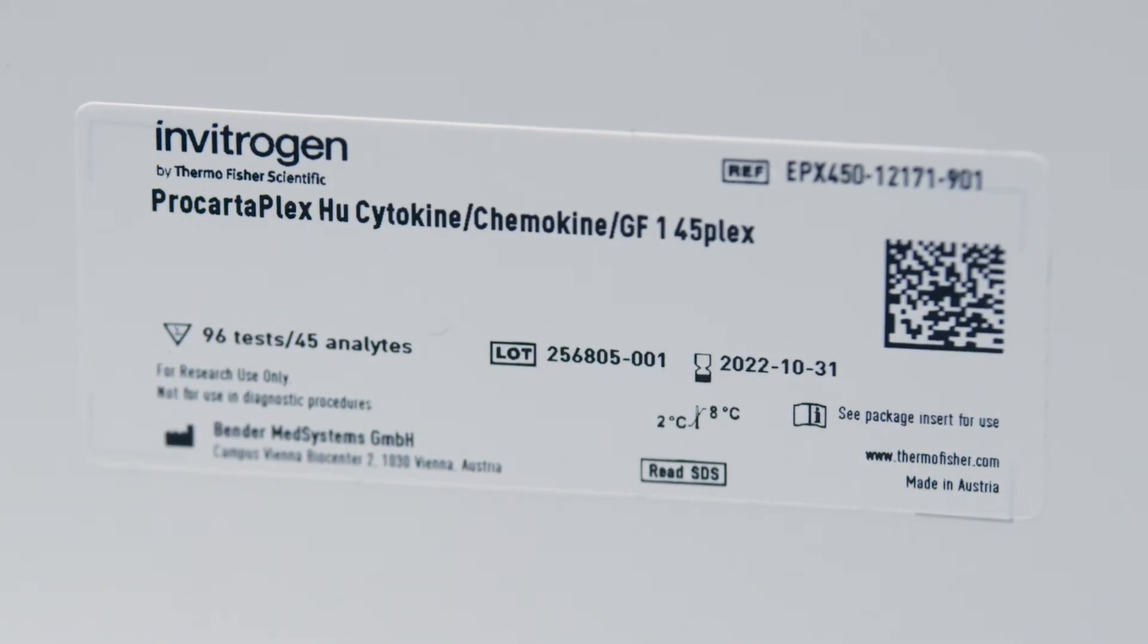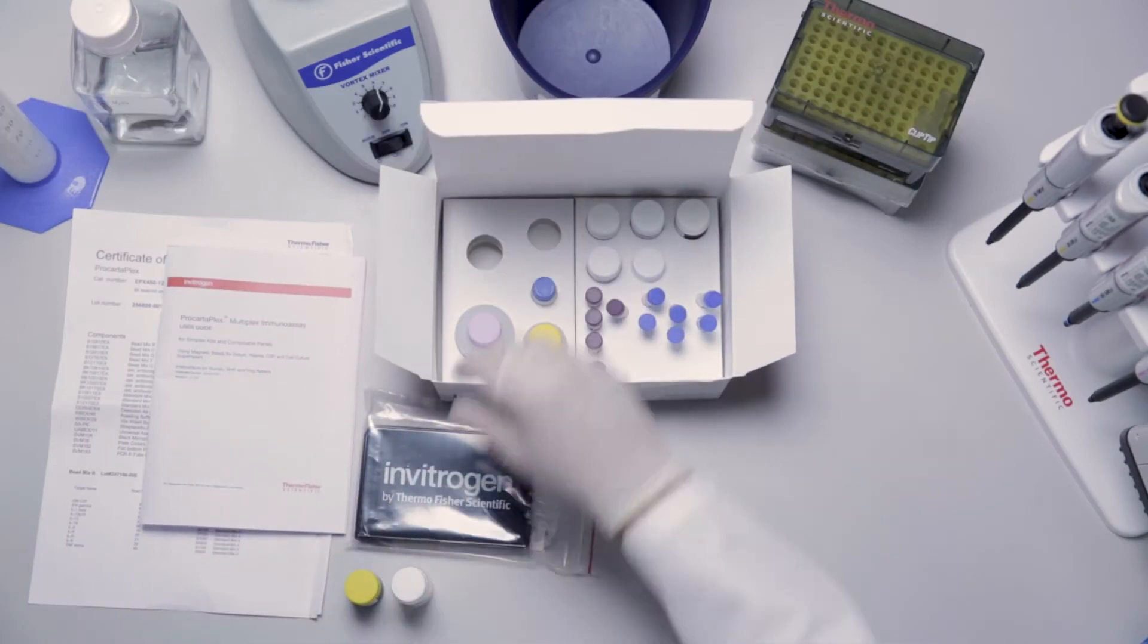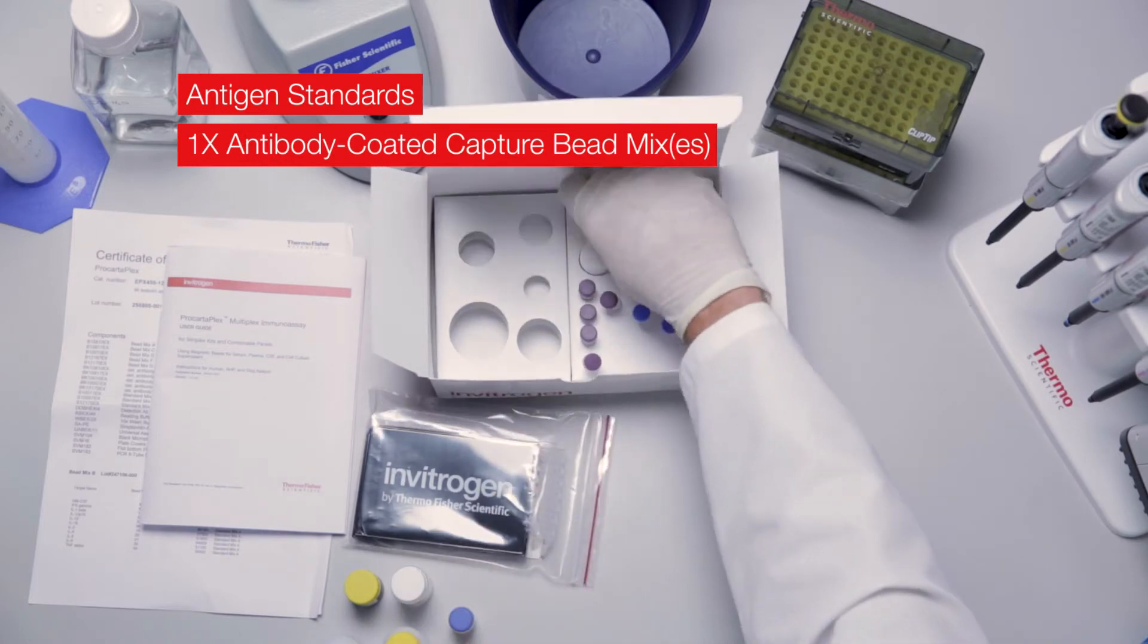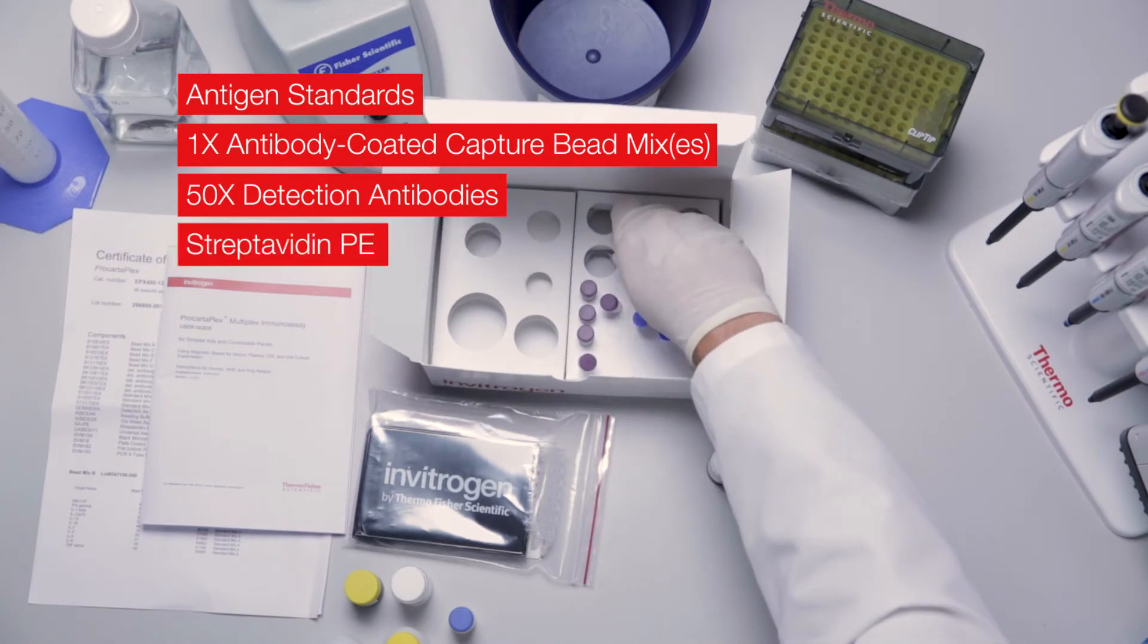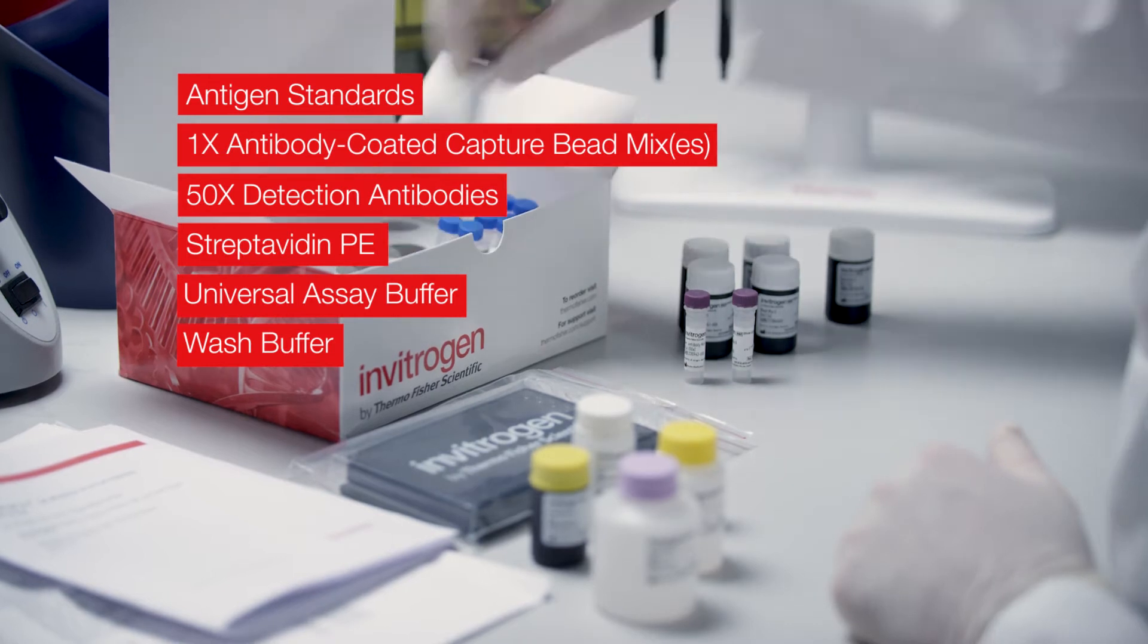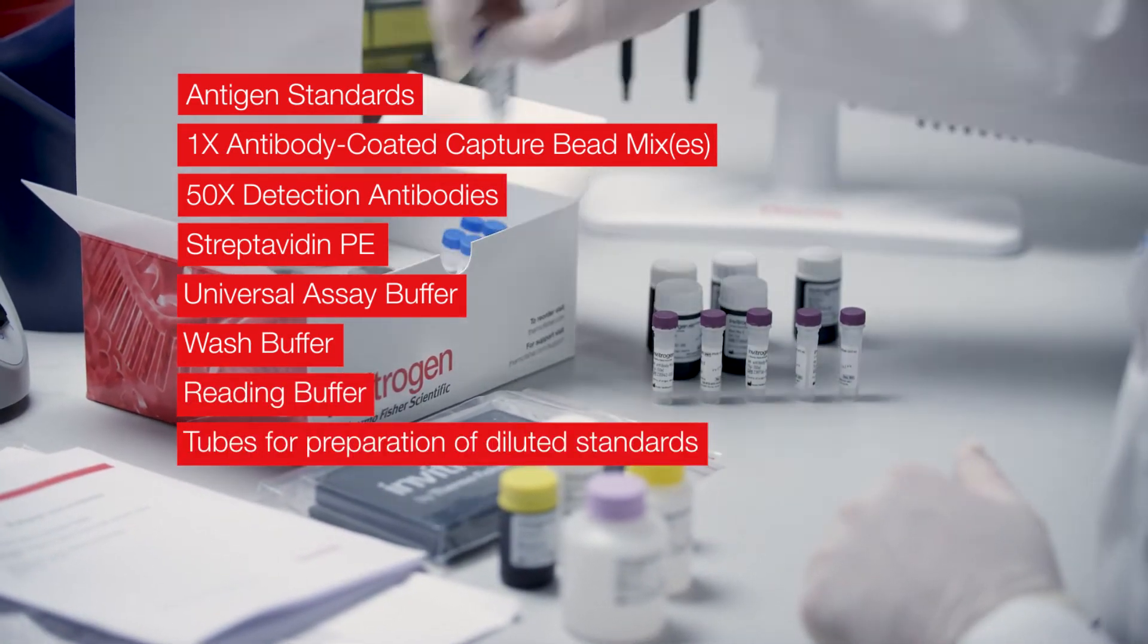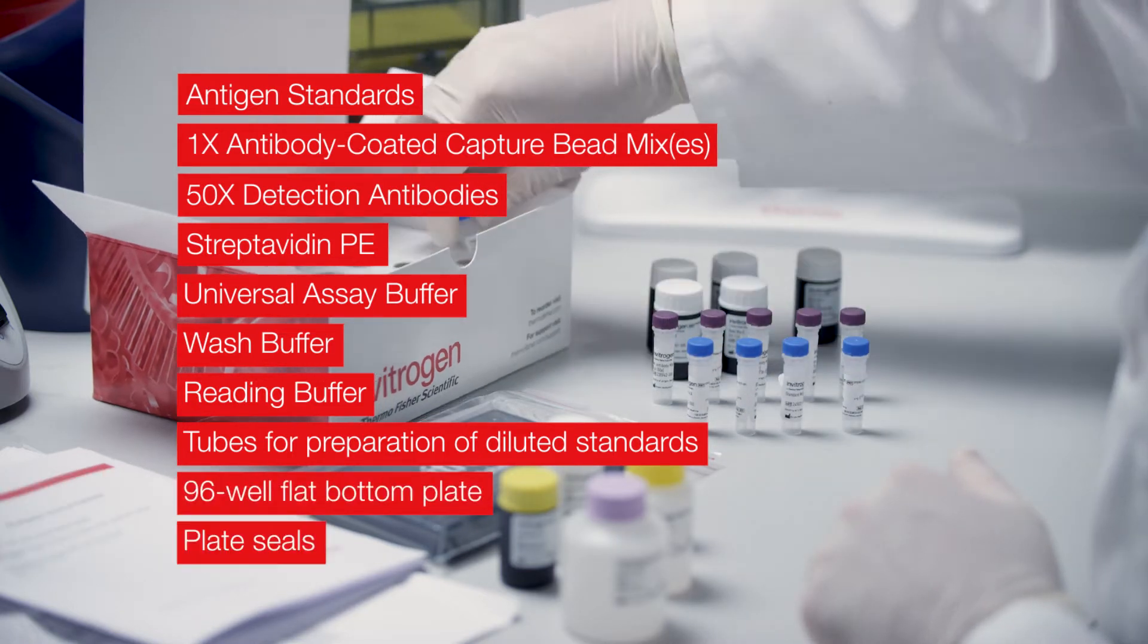The assay includes all necessary reagents. The kit contains antigen standards, 1X antibody-coated capture bead mix or mixes, 50X detection antibodies, streptavidin PE, universal assay buffer, wash buffer, reading buffer, tubes for preparation of diluted standards, a 96-well flat bottom plate, and plate seals.